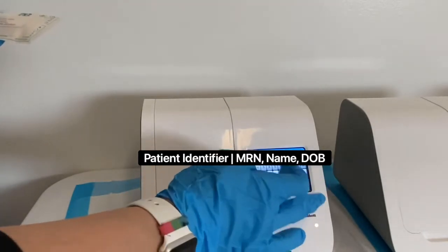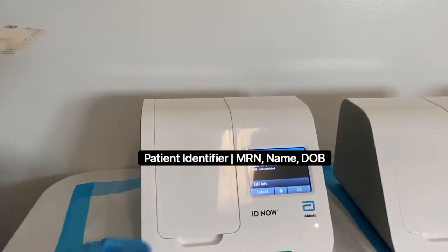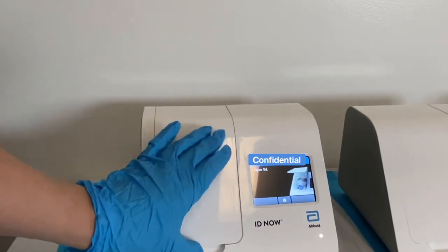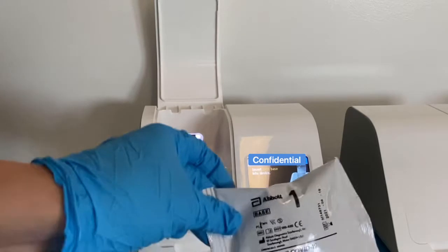After which, we follow the directions on the machine. Press the check mark, press the OK button, and then it tells you to open up the lid. So you gently open up the lid and there are two ports right there.